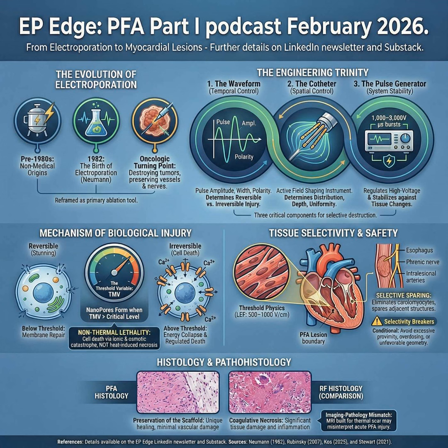Once transmembrane voltage exceeds a critical level, nanopores form. Pore formation is not a clean, deterministic hole punch. It's a phase transition with heterogeneity. Even within the same small region, some cells get sublethal pores, others accumulate lethal pore populations, especially near steep gradients. Then comes the continuum: reversible electroporation, stunning, delayed death, and irreversible electroporation.